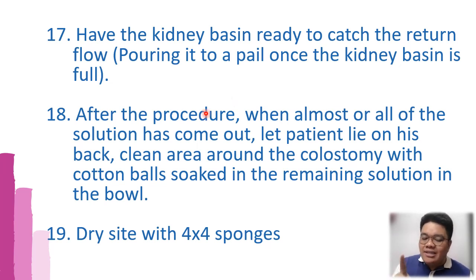Class, when you are drying the site of your colostomy, do not rub it like this. Do not do it like that. Instead, class, you need to pat it dry. If you will be rubbing it, you might be scratching some part of it, leading to injury. We don't want that to happen.